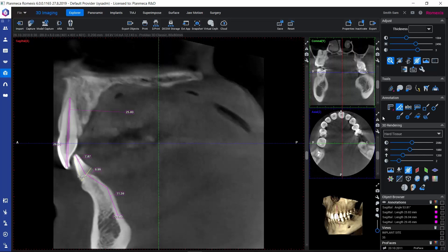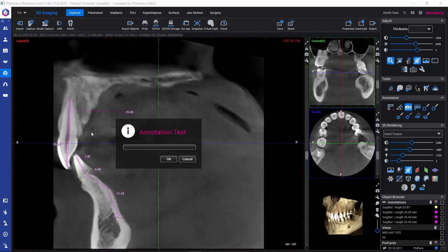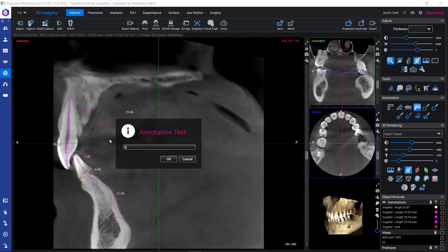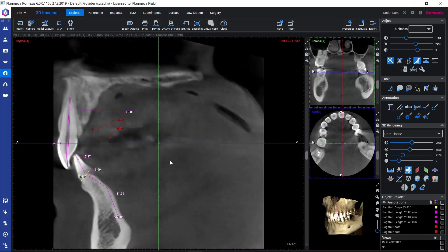We can also add text annotations using two tools. The first lets us add a plain text annotation, while the second adds an arrow along with the text, which we can use to highlight in more detail what our text annotation is pointing to.